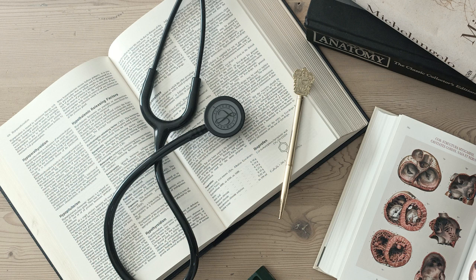Absolutely. This is a medical emergency. Standard ST segment changes, which are usually your key for diagnosing ischemia or infarction, are incredibly difficult to assess accurately in LBBB because the presence of the block itself profoundly alters ventricular repolarization and the ECG, often masking or mimicking ST elevation or depression. This necessitates prompt biomarker testing, cardiac enzymes, and admission for urgent cardiac monitoring and workup, potentially even straight to the cath lab based on clinical suspicion, because the LBBB fundamentally alters the ECG's interpretation for ischemia.